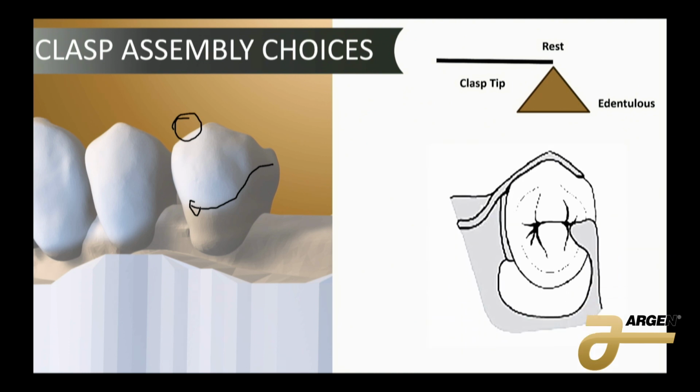We're going to use a wrought wire. By using a wrought wire, instead of the fulcrum moving the whole thing, the wrought wire itself is going to bend. So you can look at our fulcrum here. The wrought wire material goes down. Only the wrought wire. Nothing else is affected. That's why we might use a different, more flexible material in this situation.